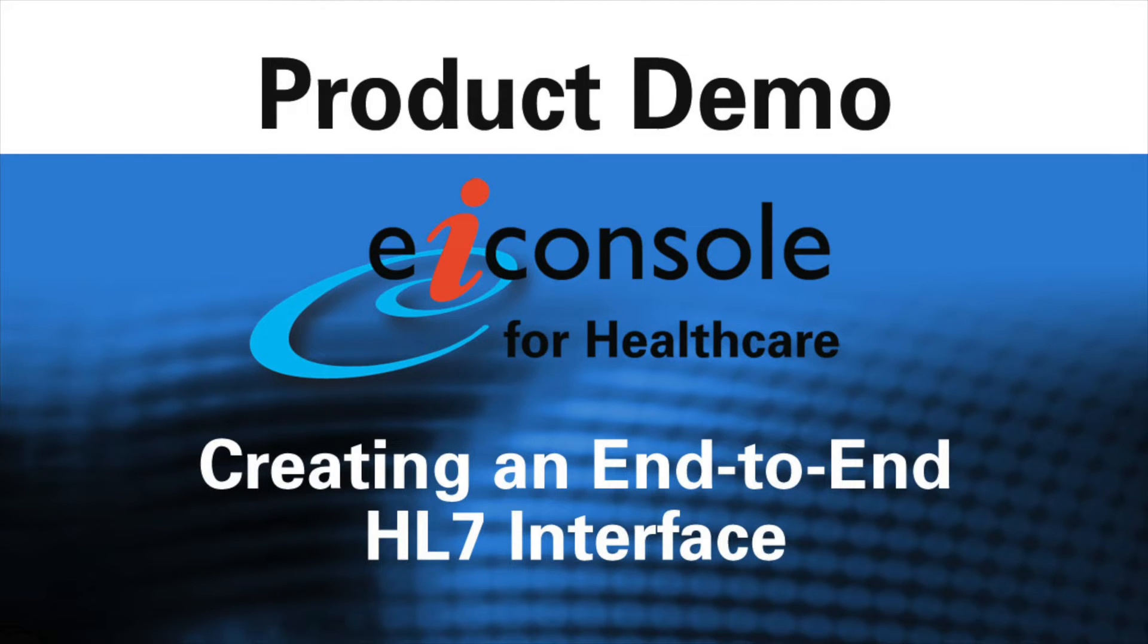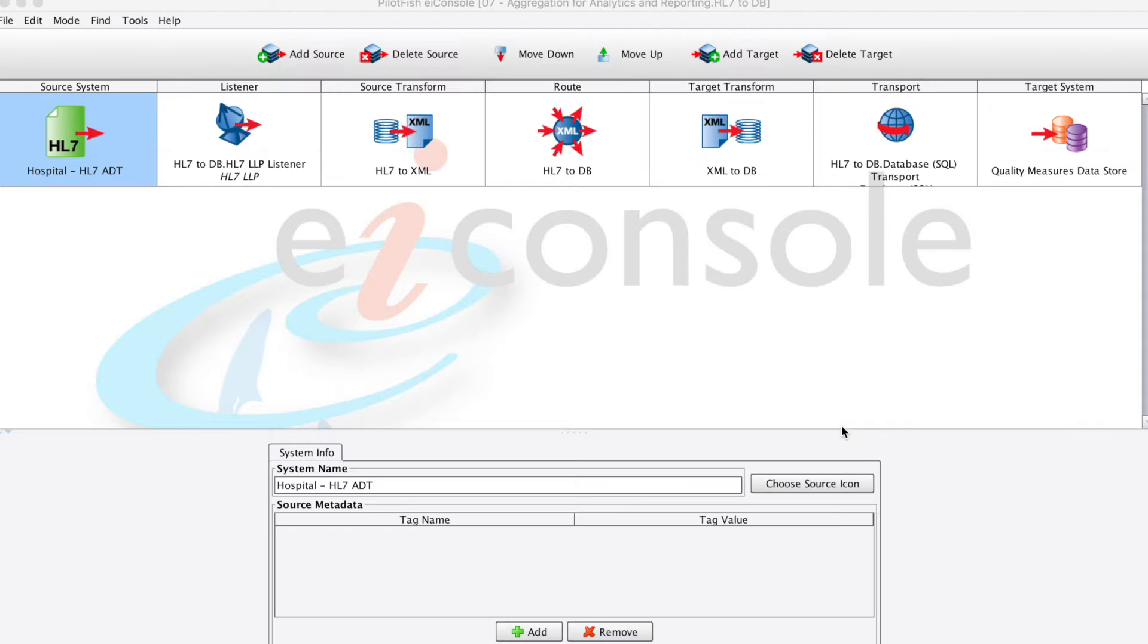Welcome. In this demonstration you will see some of the unique capabilities of the EI console for healthcare. In this example, HL7 is coming from a hospital and then sent on to a data measure store or a database.